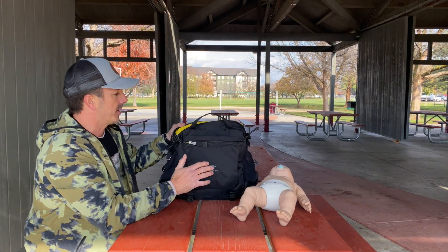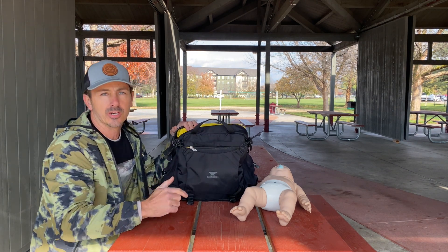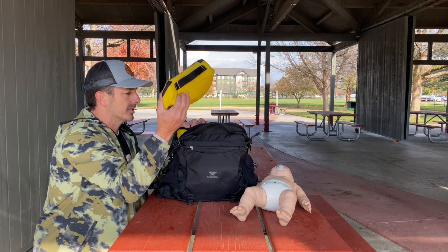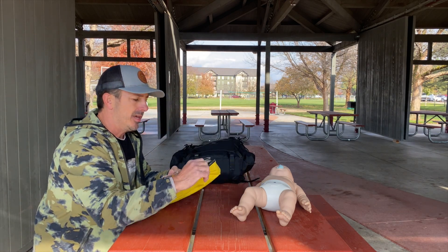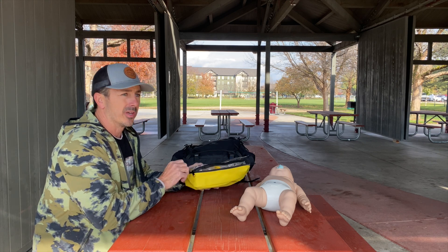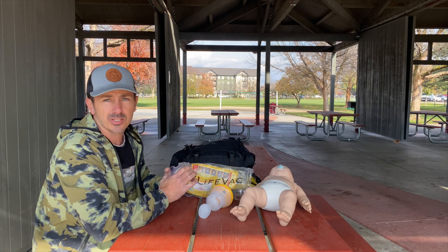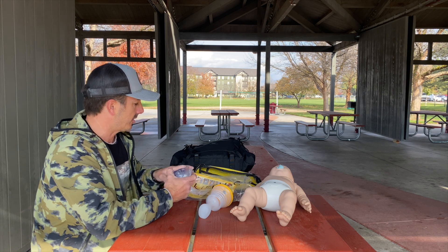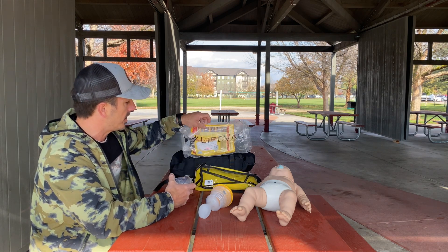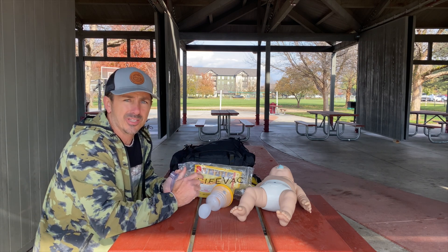Hey, what's up, you guys. We just finished up a first aid CPR class for a bunch of kids and we are at the park. The only thing we're going over today is the Life Vac that we carry. The Life Vac is a secondary device for us to use when traditional choking methods fail — back blows, chest thrusts, abdominal thrusts, Heimlich maneuver — and they failed. I believe in a secondary device because we've had to use one to save children's lives in the fire department as a medic.